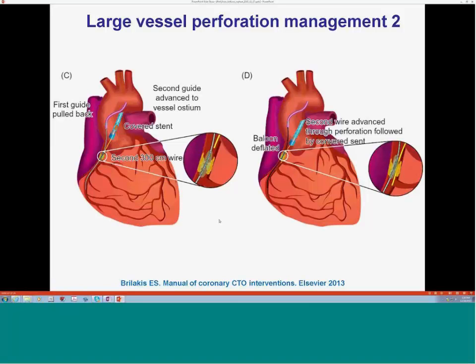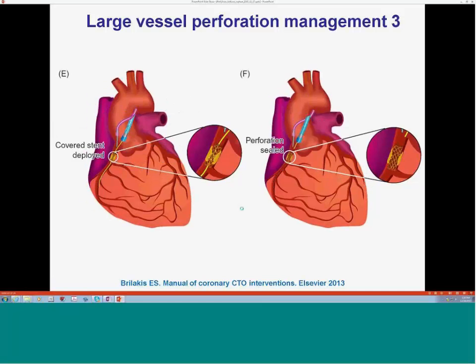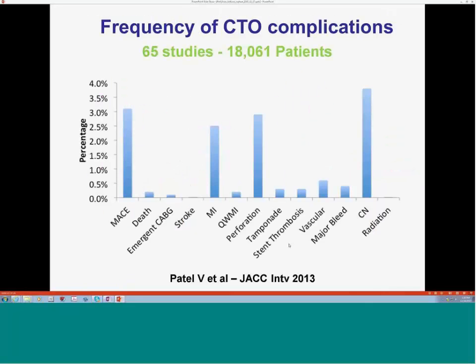And again, with CTO, it's not very hard to do because you're really going to have 2 guides anyway, so it's not a big deal for CTO. It might be more of an issue in a non-CTO, but then you get the balloon up and wait and see what happens, and then with the covered stent, hopefully that will take care of it.